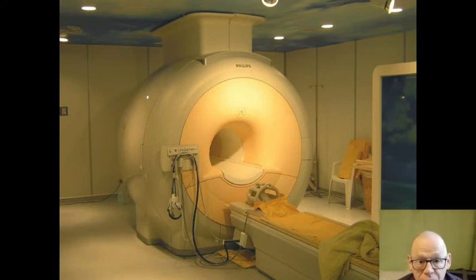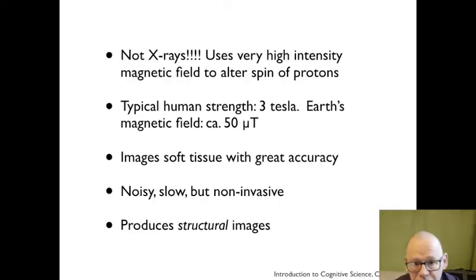So it's a bit claustrophobic, and you must remove all metal before going in or it'll be torn out of your body. So it's not a very pleasant place to be, but it gives us very, very high quality images, and it does no damage to the body. This is not X-rays, so there's some confusion here. X-rays are a much older technology used to produce a certain kind of image. X-rays damage the tissue that they pass through.